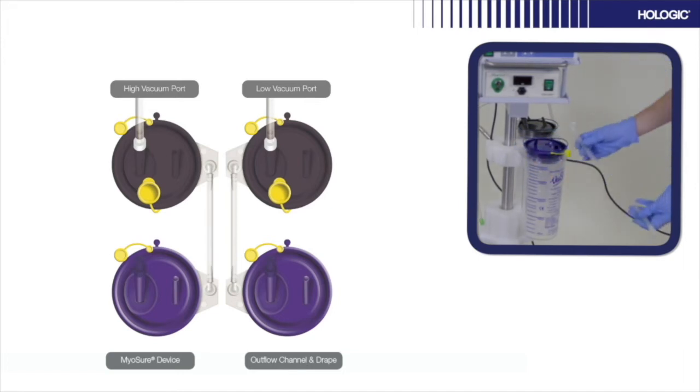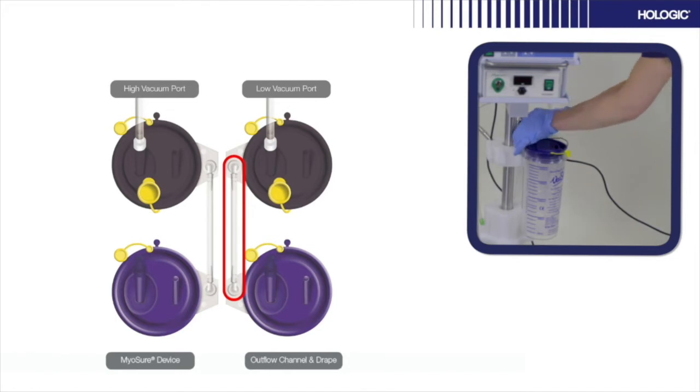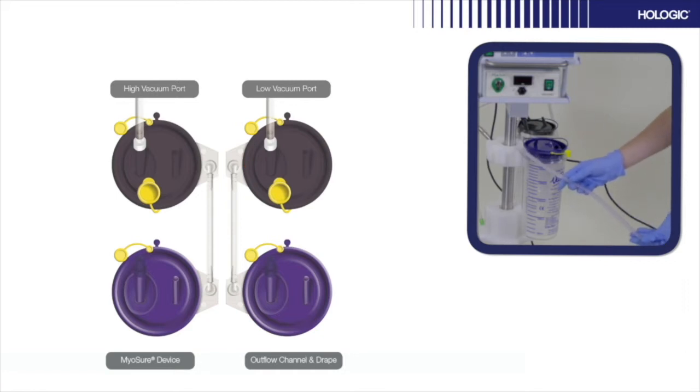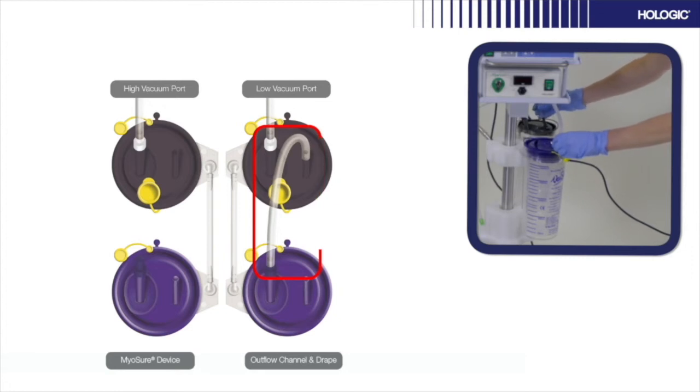First, ensure the reusable vacuum tubing is connected in the centre of the canisters. This tubing is reusable and only needs to be replaced if moisture or damage occurs. Now attach the tandem tube from the front to the back canisters as shown. Blue always to the front and ensure a tight seal at both ends. This can be a common troubleshooting recommendation.